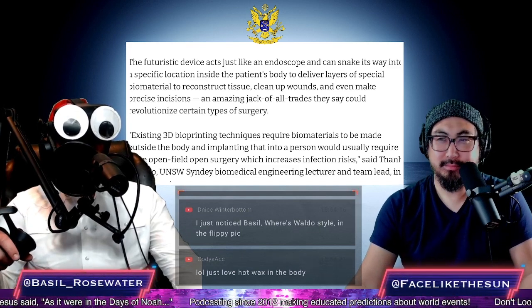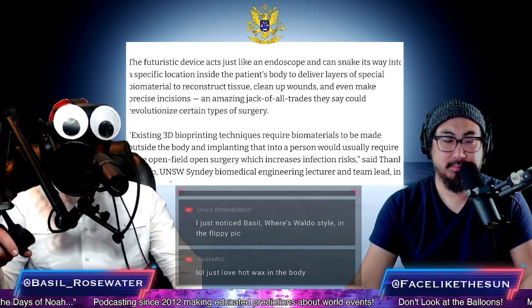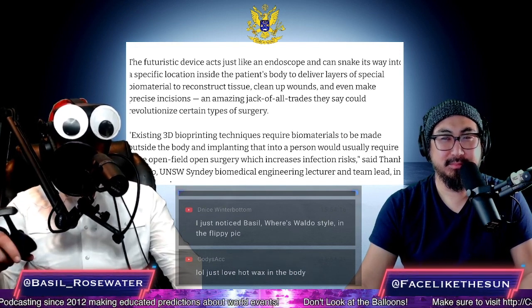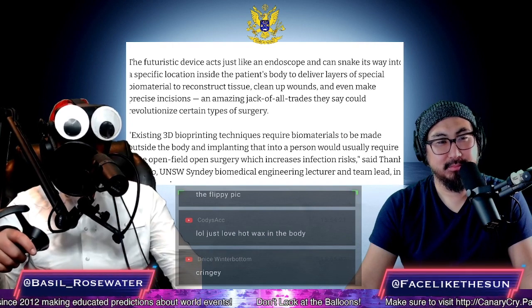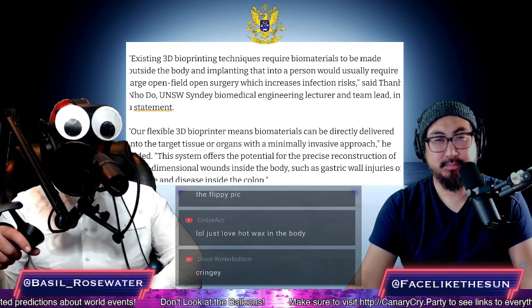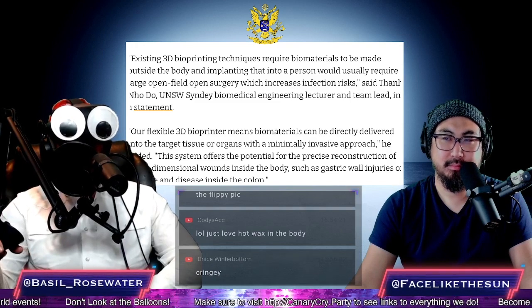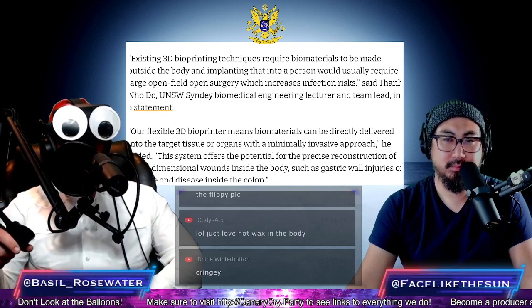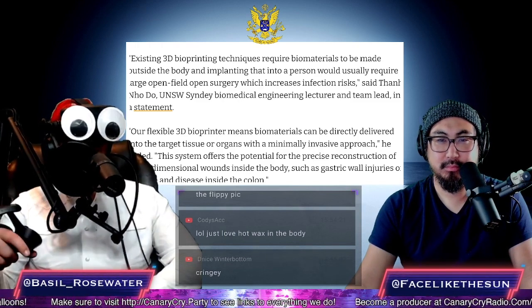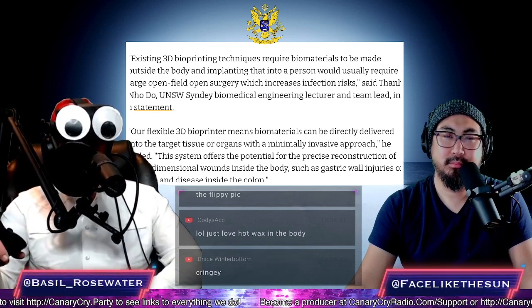Into a specific location inside the patient's body to deliver layers of special biomaterial to reconstruct tissue, clean up wounds, and even make precision incisions. An amazing jack of all trades, they say, could revolutionize certain types of surgery. Quote, existing 3D bioprinting techniques require biomaterials to be made outside the body and implanted into a person. Implanting that into a person would usually require large open-field surgery, which increases infection risks, said Tan No Do, UNSW Sydney biomedical engineering lecturer and team lead, in a statement.